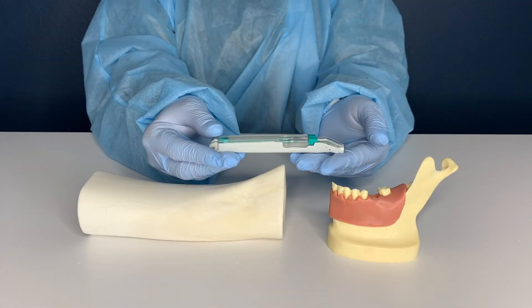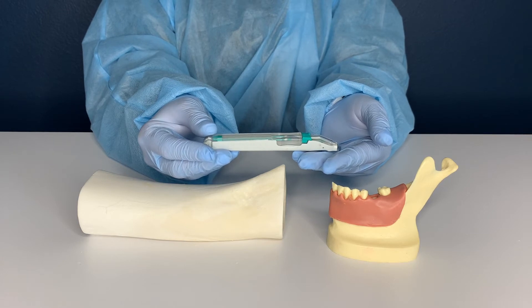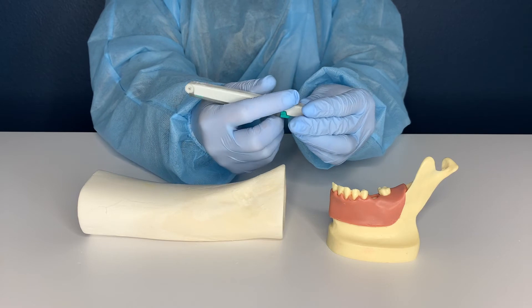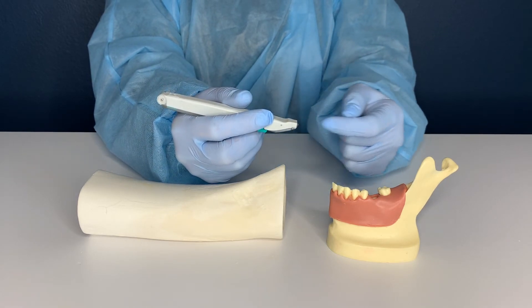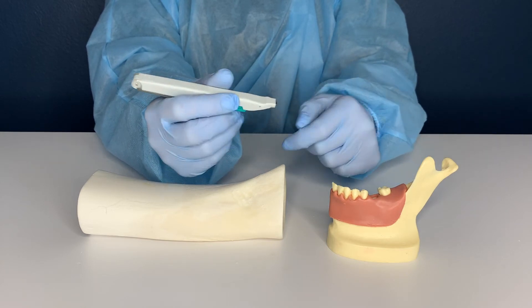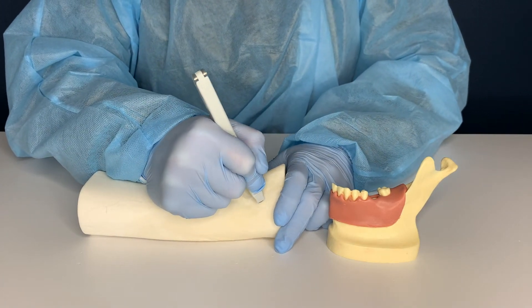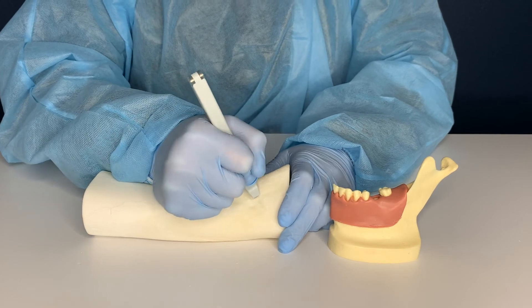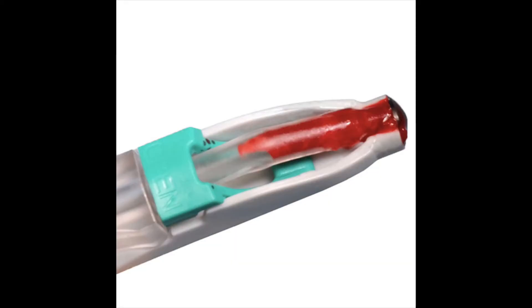To harvest bone using the Smart Scraper, hold the instrument with a pencil grip with the transparent side oriented towards the patient's bone. The cutting edge is located at the tip of the syringe portion of the device. Place the cutting edge on the bone, apply pressure, and drag the blade across the surface of the bone. The bone will collect in the tip of the syringe.